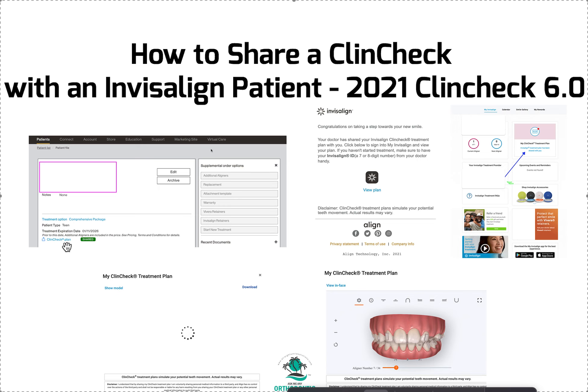There are a lot of steps. You have to do your part right, then click that share button. The patient is going to get an email and a text saying their doctor has shared their ClinCheck with them. Then they do their next steps — they have to download the app and finish registering.